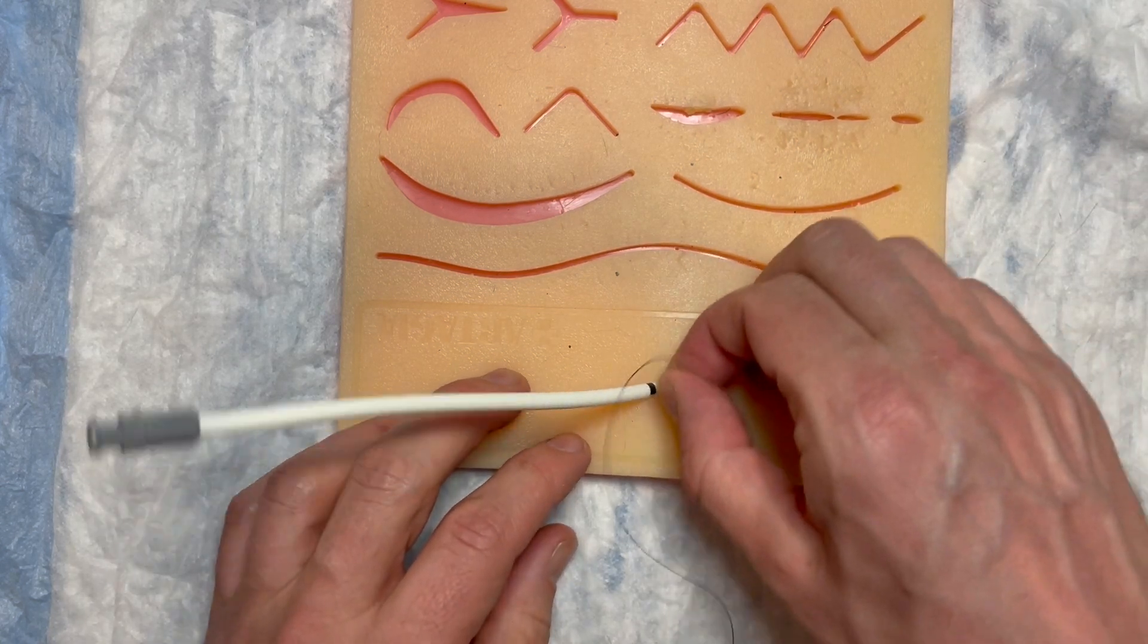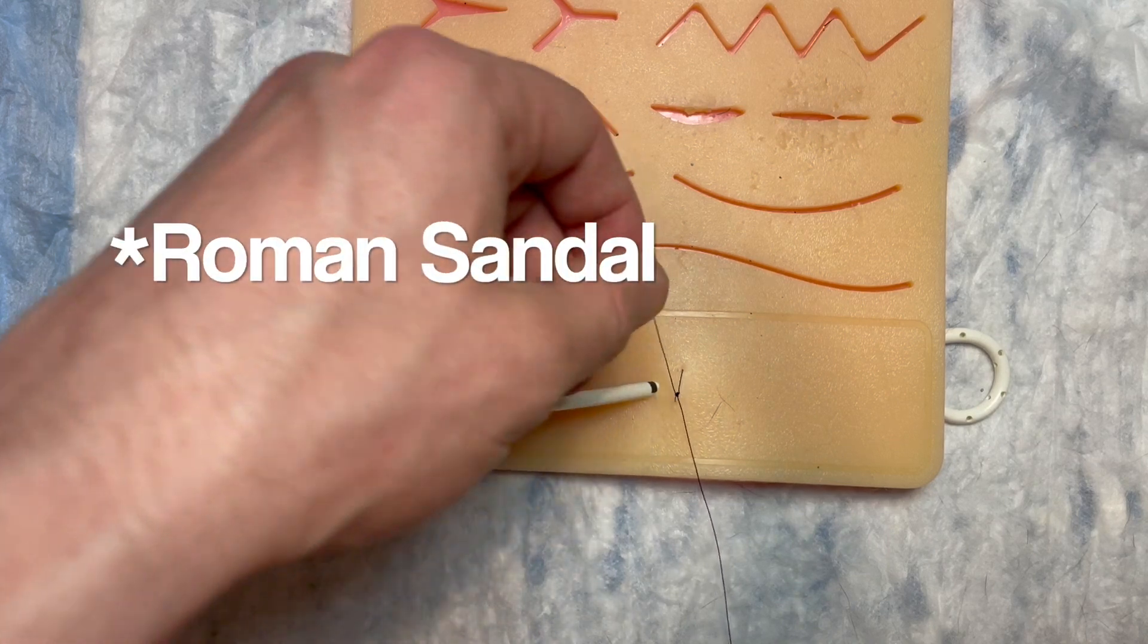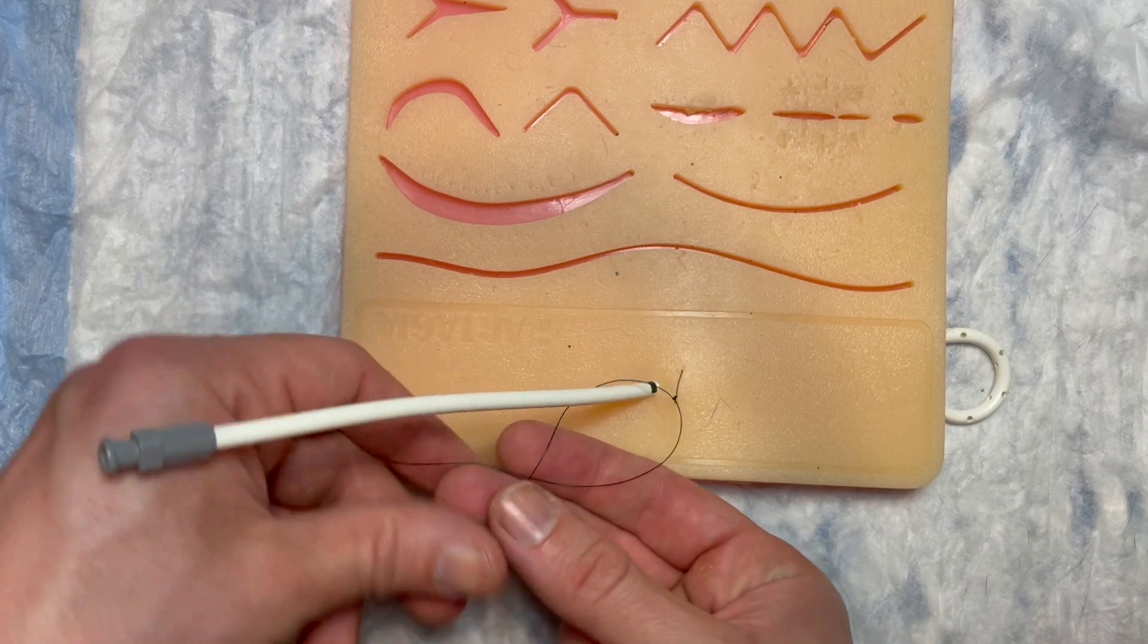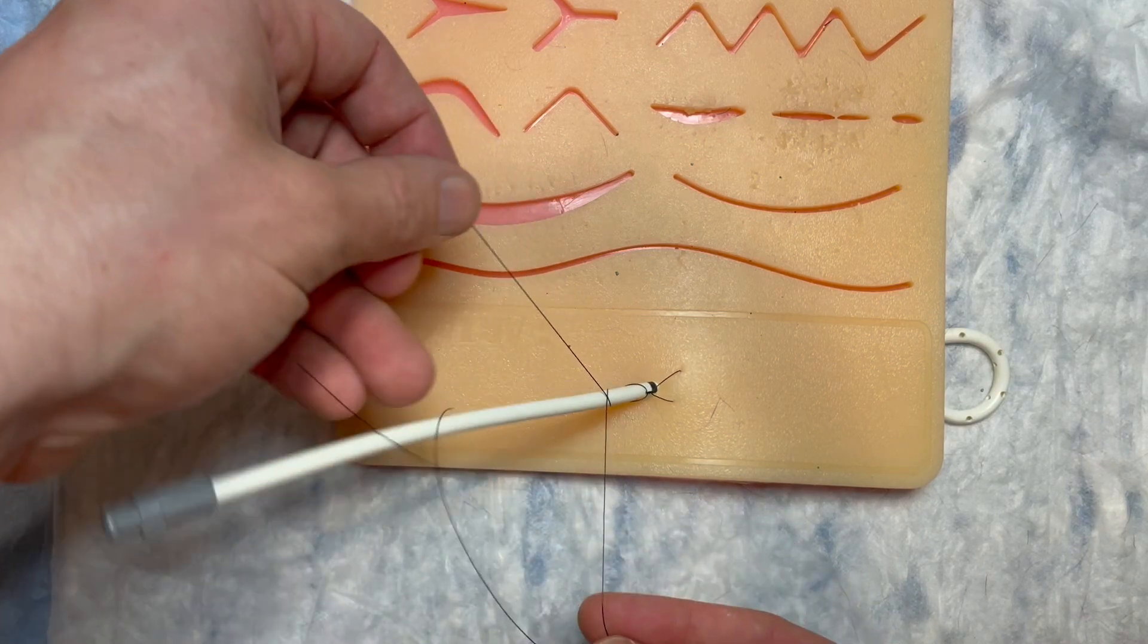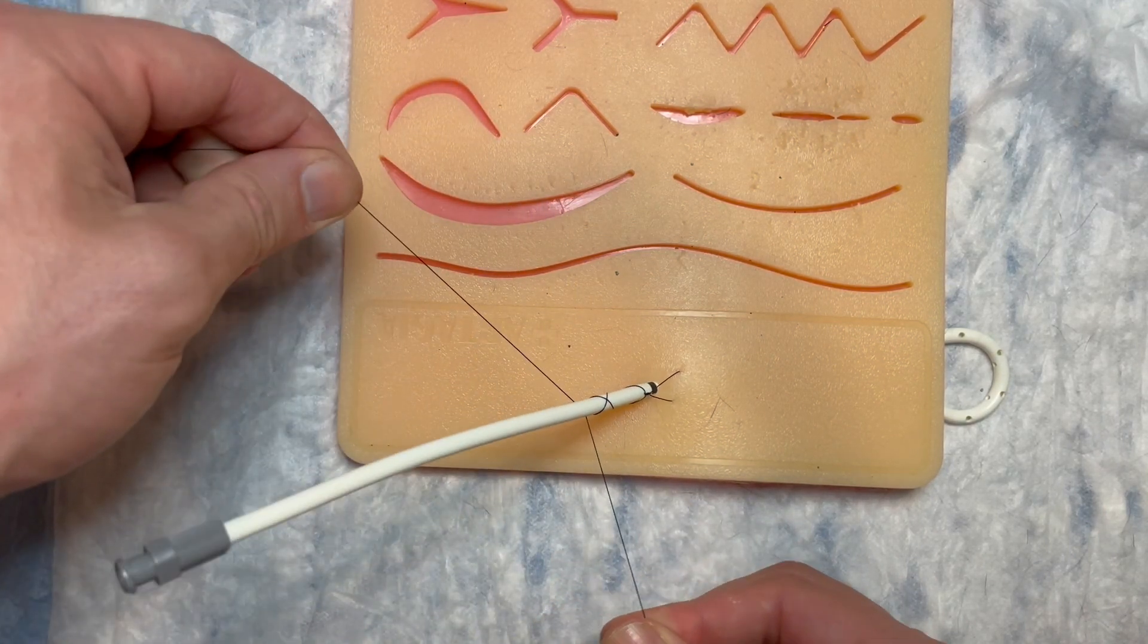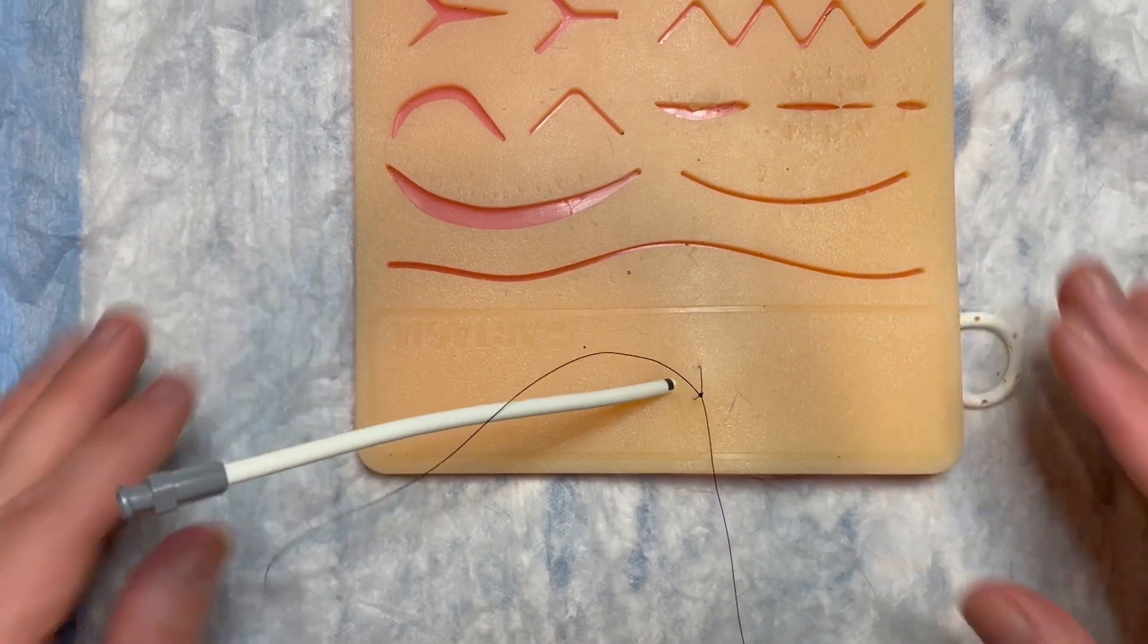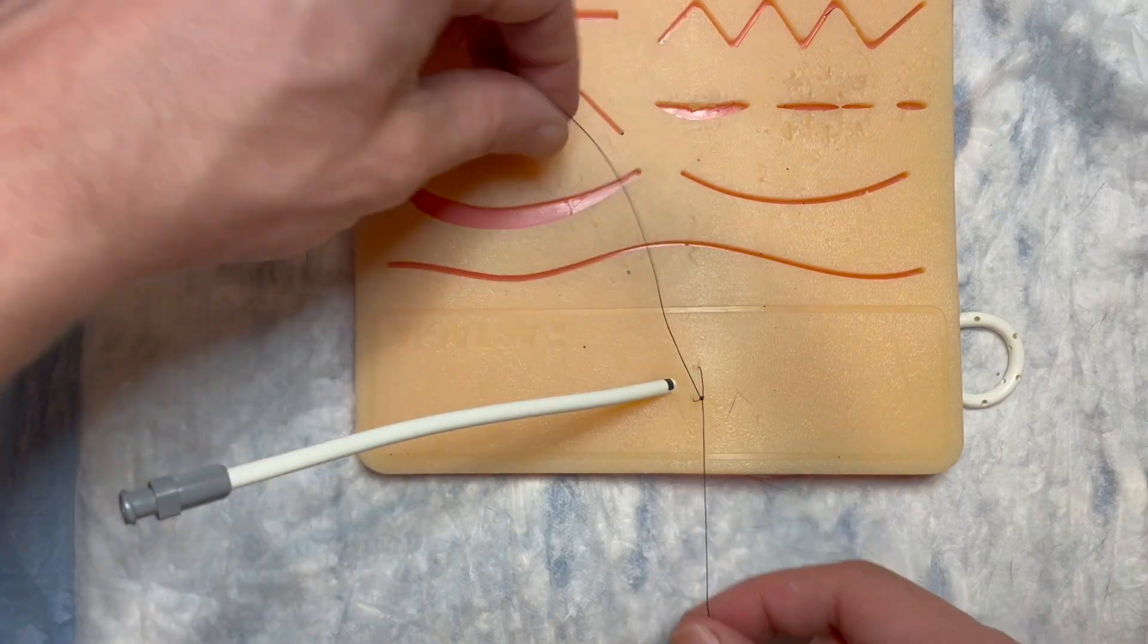Okay, so got my first knot in place. Now I am very anti purse string, it's very confusing, that's where you go wrap under a couple of times and you wrap over and then under under and then you'd start tying this off. I find it to be confusing and there's a much better way to go about this.